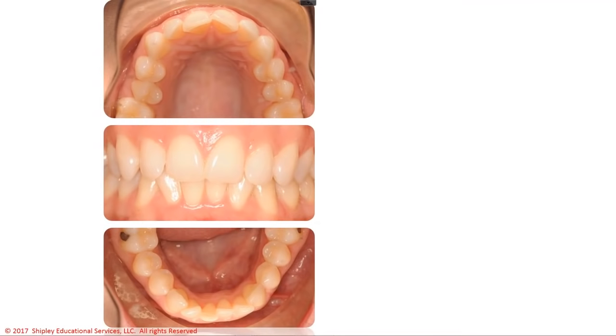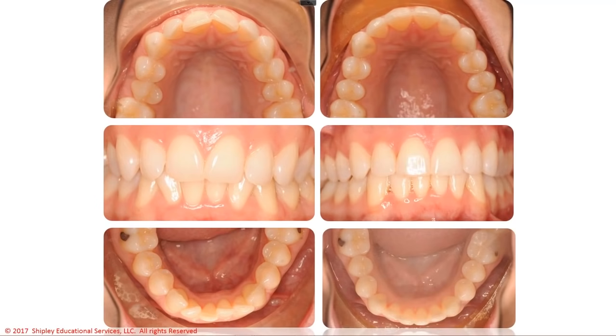Here's another one. In this case, these lower lateral incisors' roots are distally tipped, hard for the Invisalign plastic to grab onto, with moderate upper and lower crowding. A patient like this would likely never consider doing Wilckodontics, but she did choose to do the micro-osteoperforations. So here we are when we're done. Again, we change the aligners every 3 days, but she actually chose to start the Propel process on aligner 6.